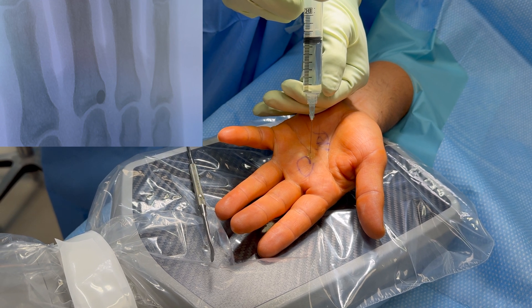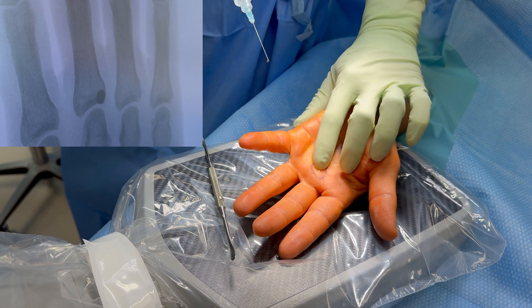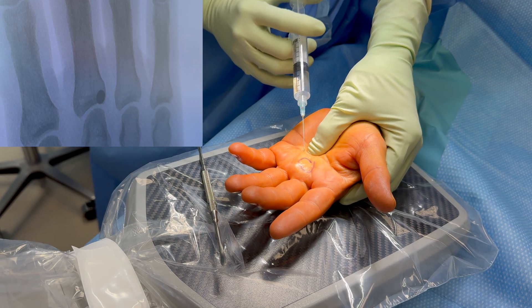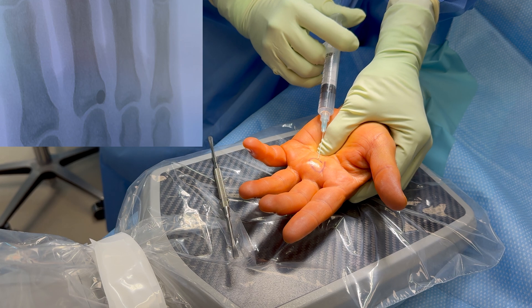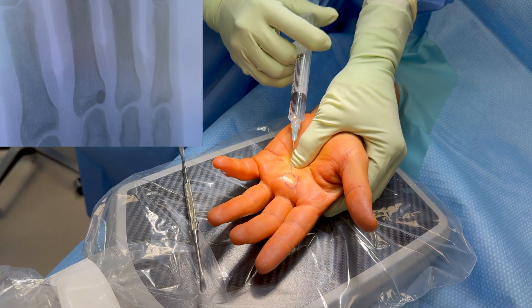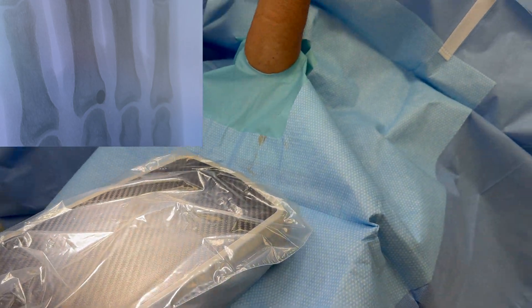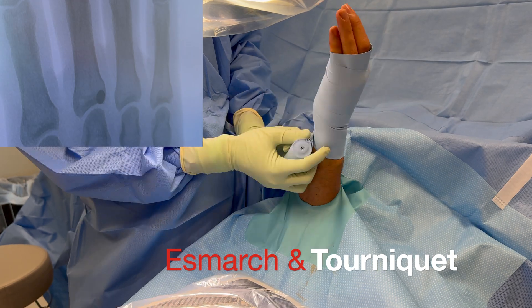The patient is being done under straight local anesthetic without any sedation. We typically use 1% lidocaine and half percent ropivacaine for our anesthetic. The half percent ropivacaine lasts a little bit longer, anywhere between six to eight hours. I'm a big advocate of using the long-acting ropivacaine or bupivacaine because it helps with the pain postoperatively and limits the amount of pain medication the patient needs to take.